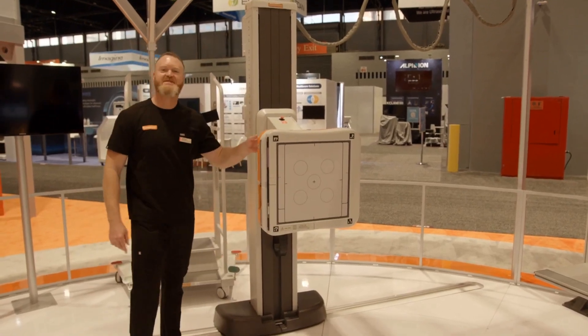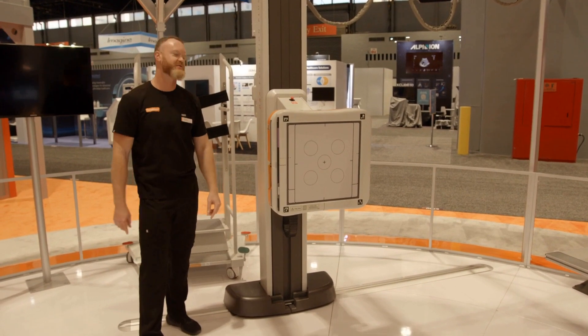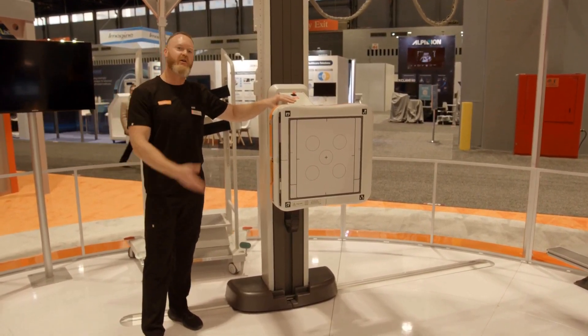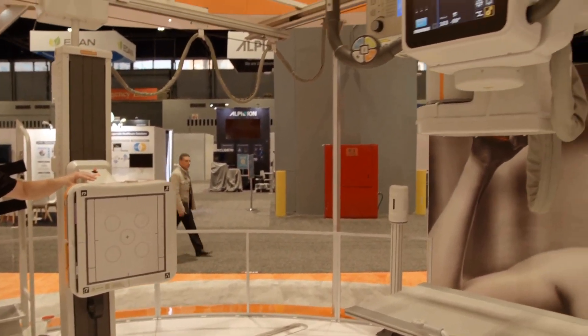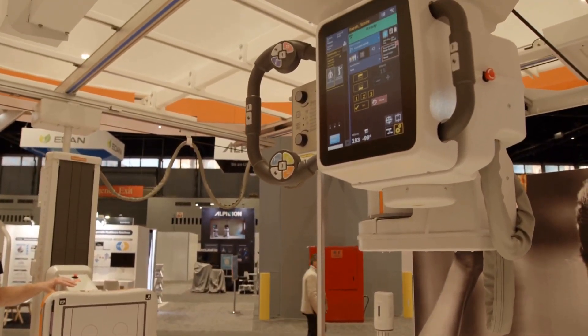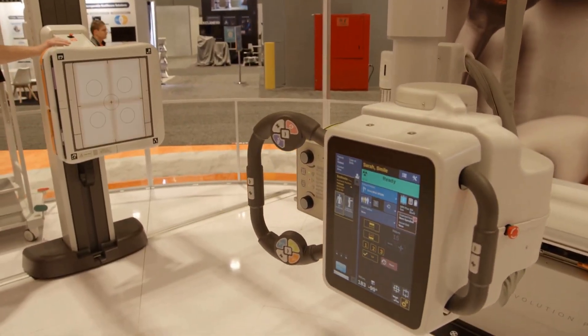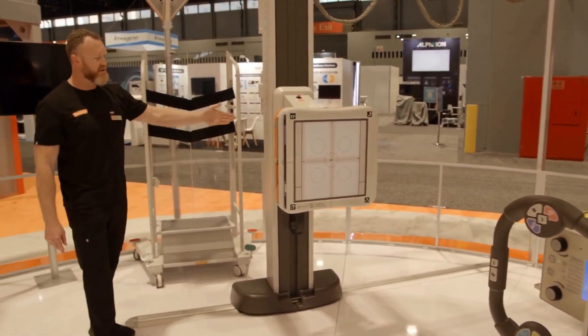Okay, here we are at the wall stand. We'll take a look at some of our additional motorization and automation features. I'm going to use my auto-centering feature to call the tube over to the wall stand. I'm going to demonstrate the track feature — this is an option for your wall stand with the Evolution to put it on a track.